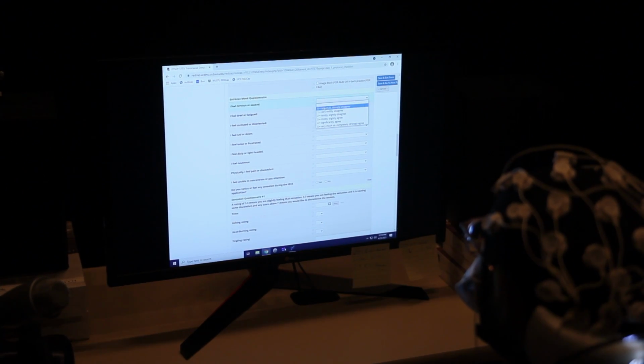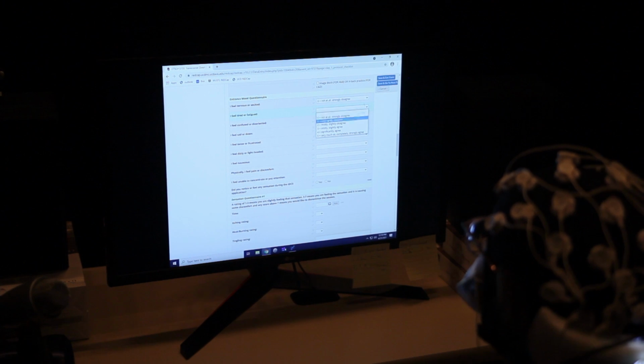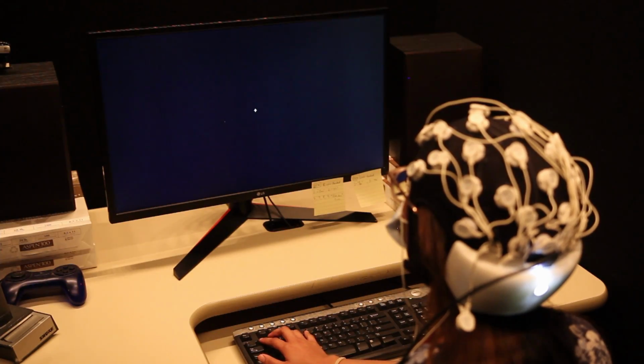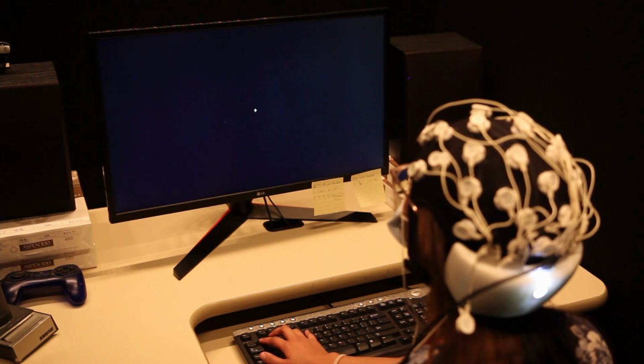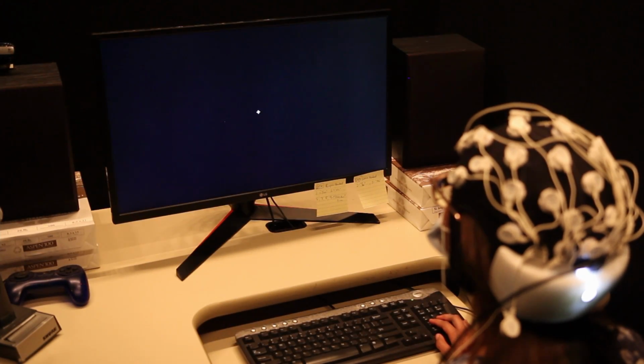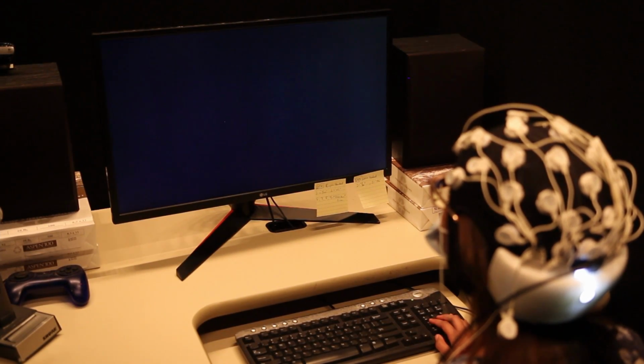We will ask you about your mood and any sensations you might experience before, during, and after tDCS. During tDCS, you will either complete a computer task or watch a slideshow. This will also be chosen by chance. After this portion of the study, you will complete the second computer task while EEG is being recorded.